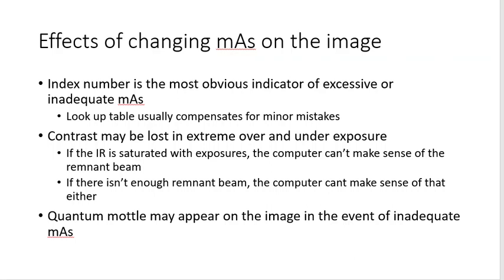type. And what I mean by that is that when a hospital or a clinic gets a new set of equipment, maybe a new DR room, then what's going to happen is a radiologist, maybe a couple of radiologists, maybe a technologist or two, will sit down in front of that computer with the applications person from the vendor from which they bought the equipment, and they're going to look at a lot of x-rays, and each one of those x-rays is going to have its own histogram attached to it.